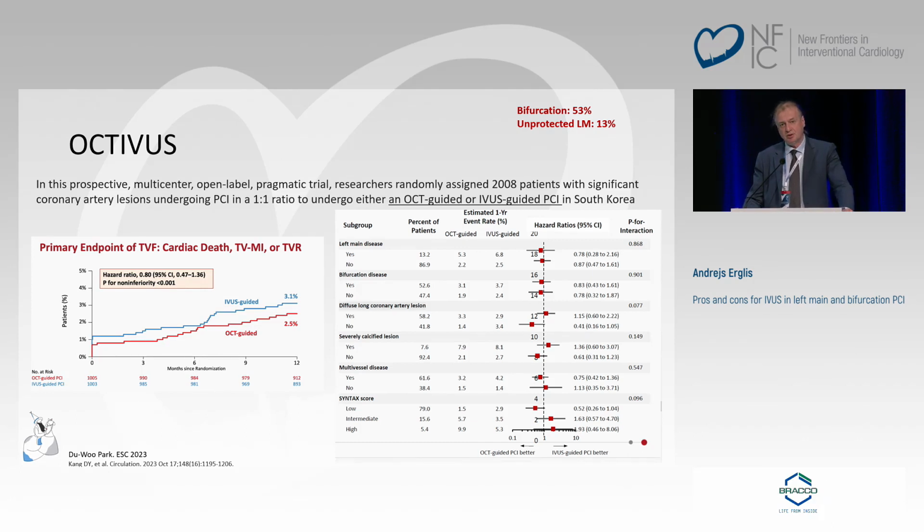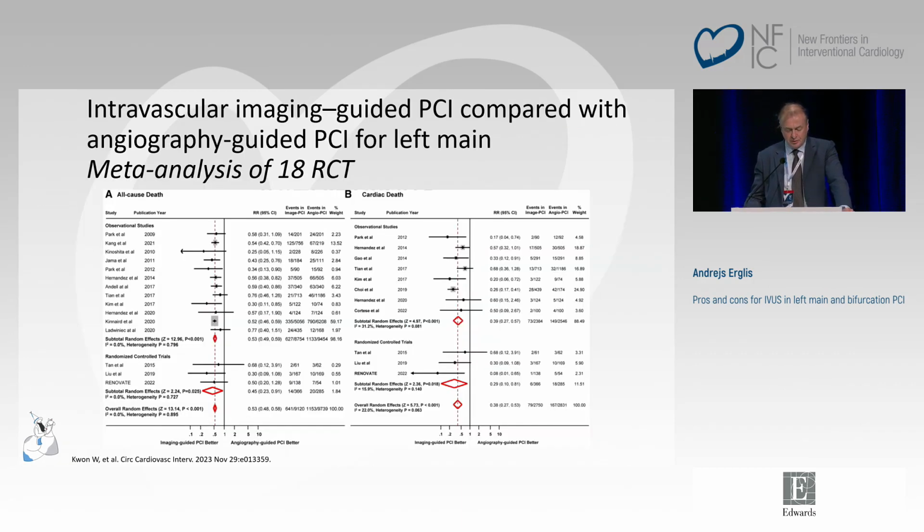And I'd say one thing also, we are mixing. I should say that we are mixing 20 megahertz IVUS. It's not the same as 60 megahertz IVUS. And this is again, nobody talks about that, but again and again, we are very far from real usage of imaging. Also, if you look, you see there's very promising data.